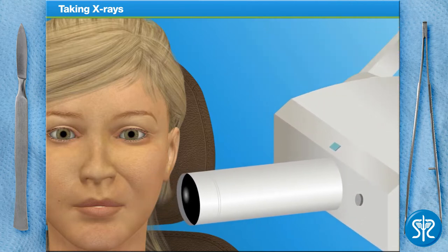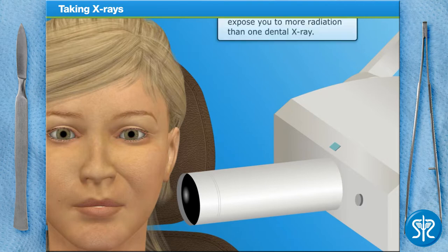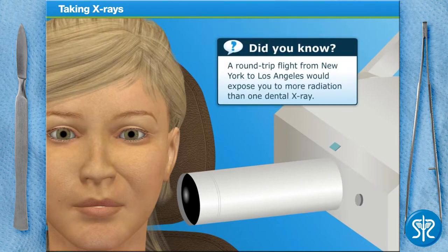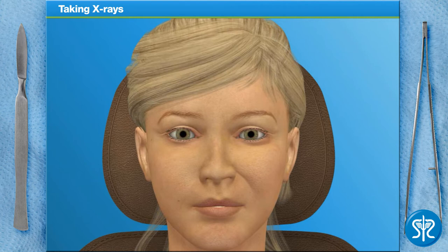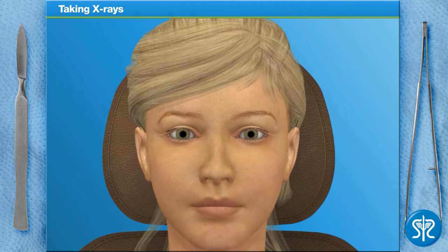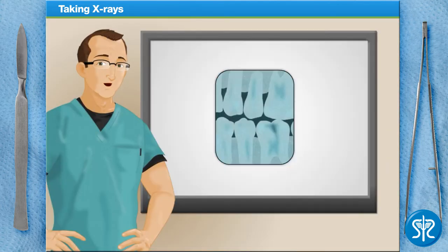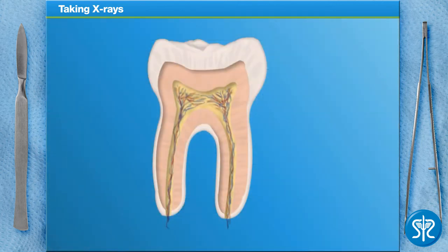With the x-ray cylinder in place, we need to get behind our radiation barrier to reduce the amount of radiation we're being exposed to and take the picture. Don't worry — the lead apron will protect our patient from any unnecessary radiation exposure. I'll have my assistant handle the other x-rays, so let's move on. With all of the x-rays completed, it's time to look for potential issues.